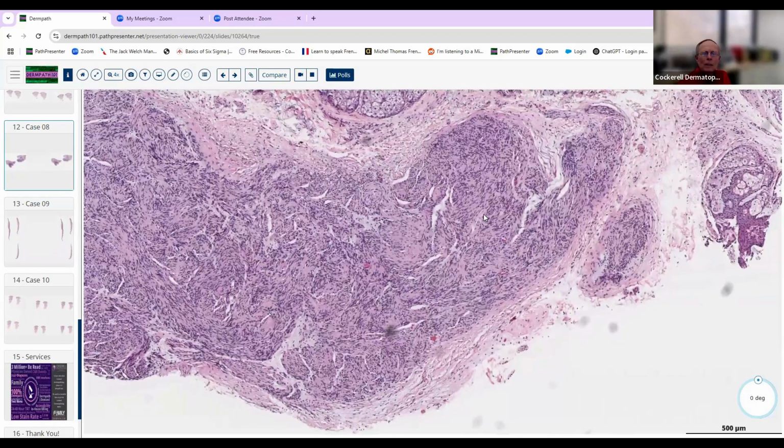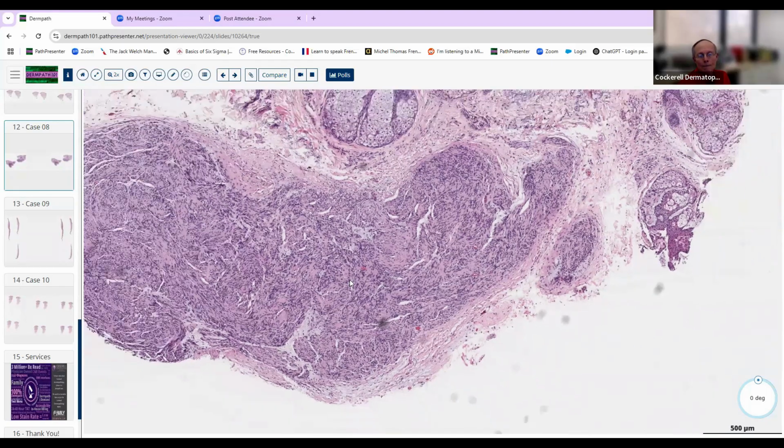Not really critical to get into being a neuropathologist on the derm boards, the derm path part of it, but you should at least understand this lesion. If you biopsy somebody that's got the multiple mucosal neuroma syndrome, the lesions can look very much like this histologically. So if you just saw this alone and they maybe show you a picture of somebody's tongue with a bunch of bumps on it, and they say this diagnosis is most likely blank, well, then I would probably answer multiple mucosal neuroma if you saw something like that.